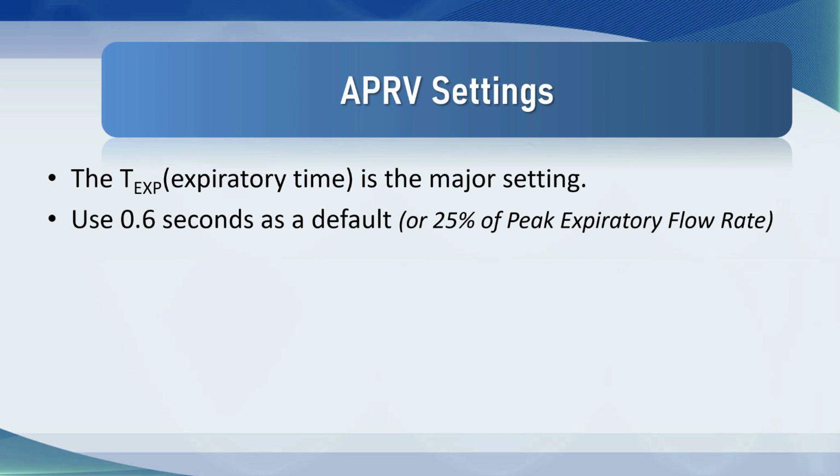but most people don't do it, and I wouldn't expect our bedside practitioners to be fiddling and sciencing it out. It's a nice thing to do if you've somebody established on APRV, trying to get that right, but initially you want to have something that you can just lock the patient on, and I think this is a good way of doing it, and set a goal release volume of less than 6 mils per kilo.